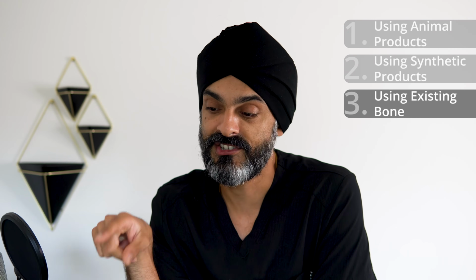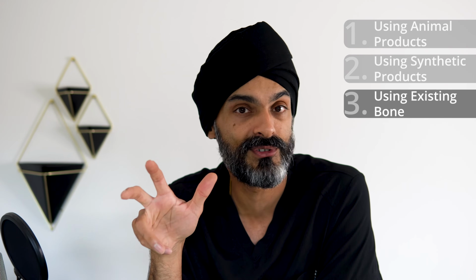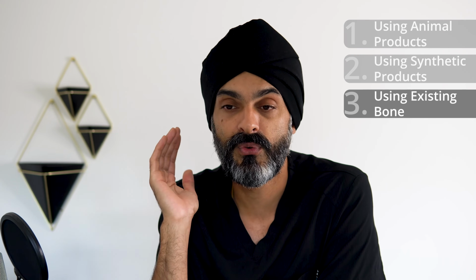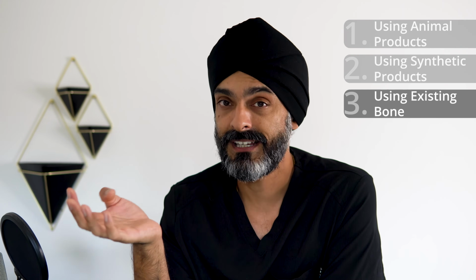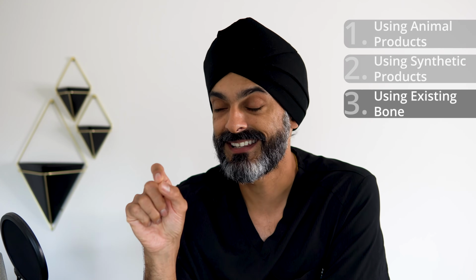Oh, one thing I forgot to mention, if you were using your own bone, the healing time is dramatically reduced. Okay, if we do one of these really complicated grafts with the bony plates and everything, typically after 4 months we're able to place implants. This is a crazy reduced amount of time.